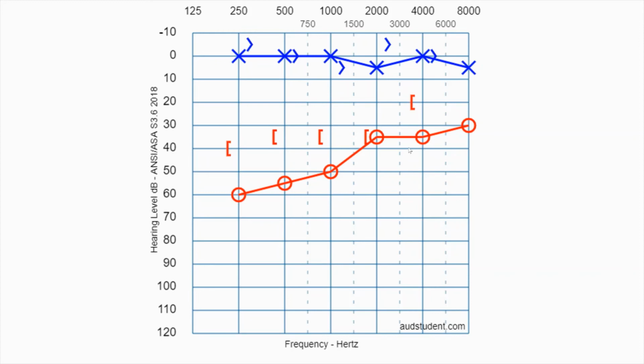Makes sense since it's an average. But how do we say that when describing an audiogram? Just like how we did. Low frequencies have a moderately severe loss, which rise into a mild loss in the higher frequencies.